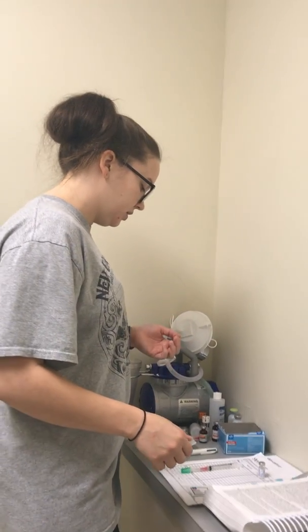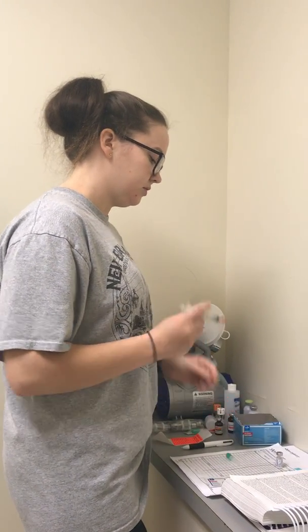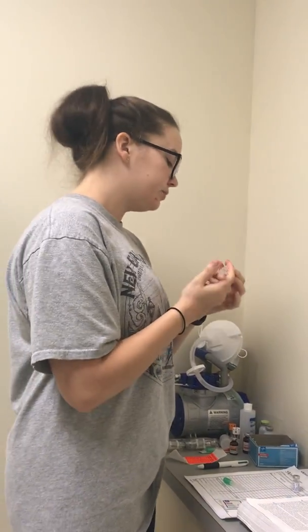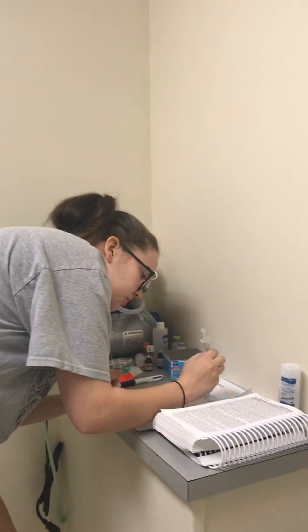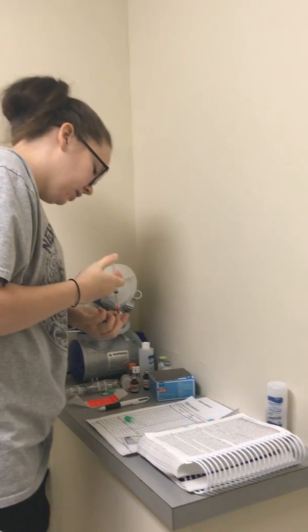We'll go ahead and take the top off. I'm going to pull back about of air. I'll go ahead once it's dry, inject it, and put the air in.